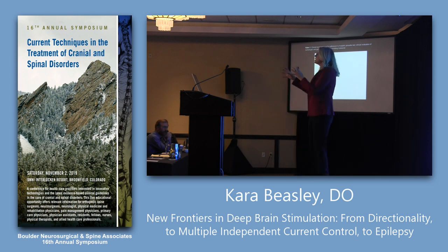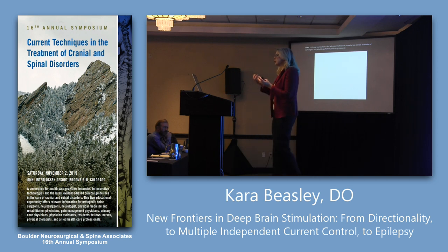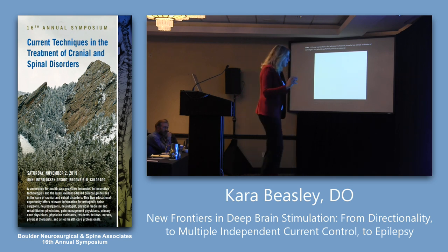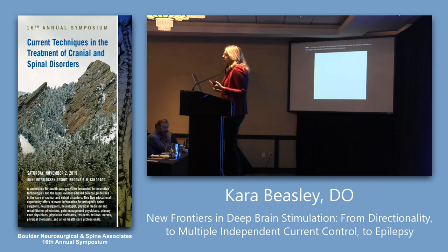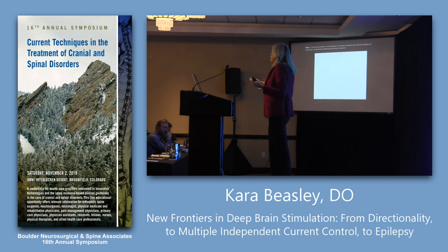And you couldn't tell which side it was from. You couldn't tell if it was the right side or the left side, what was really happening. So what you were able to do with directional stim was actually identify that it was his left leg that wasn't turning. The right leg was doing fine. So if you had him walk, you knew that you had him programmed well, he's off of all of his dopamine meds, he's doing great, but he can't turn.